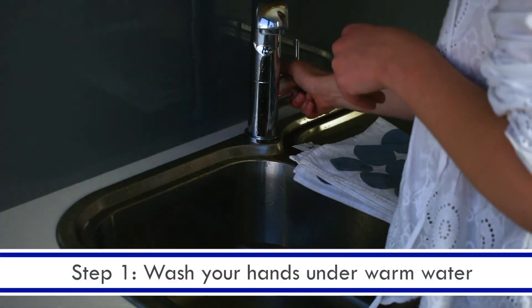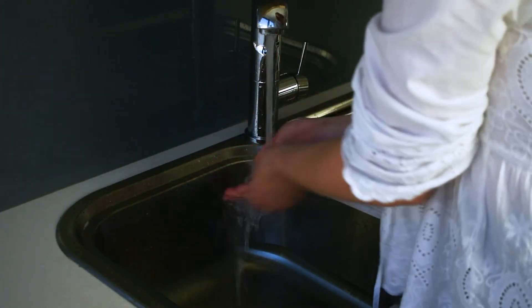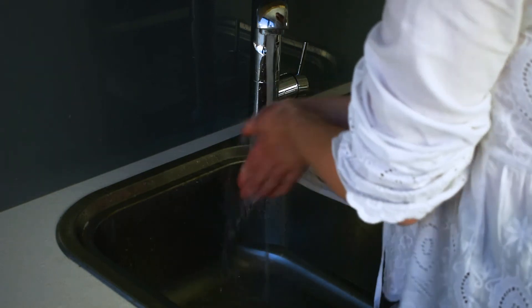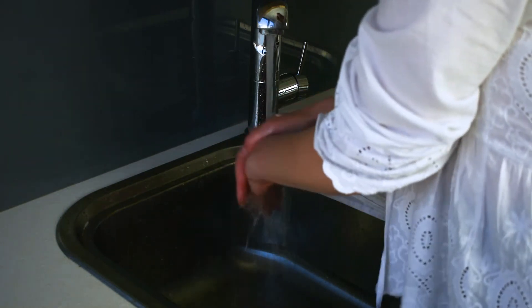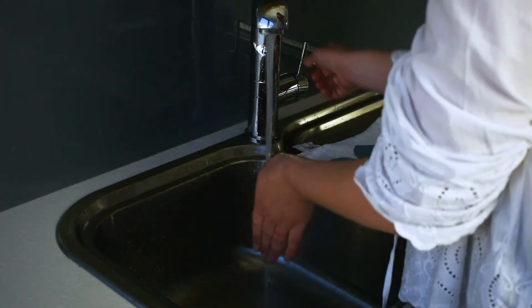Step one: wash your hands under warm water for a minimum of 30 seconds. This step is really important — obviously to clean your hands of any dirt or residue, but also the warm water helps to stimulate blood flow, which is going to help you get a better sample.